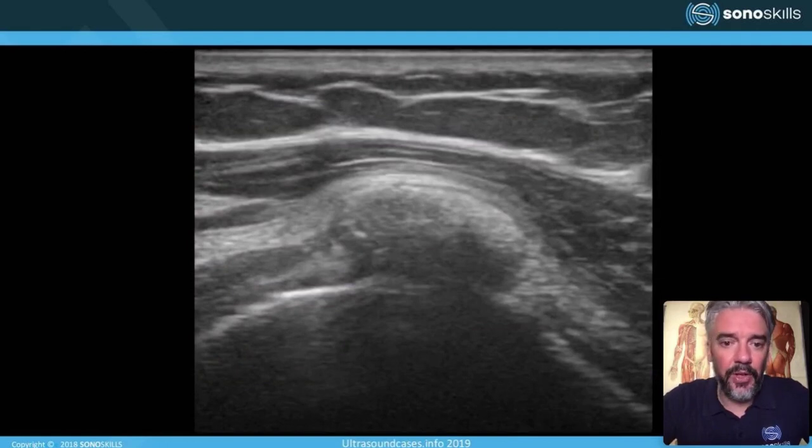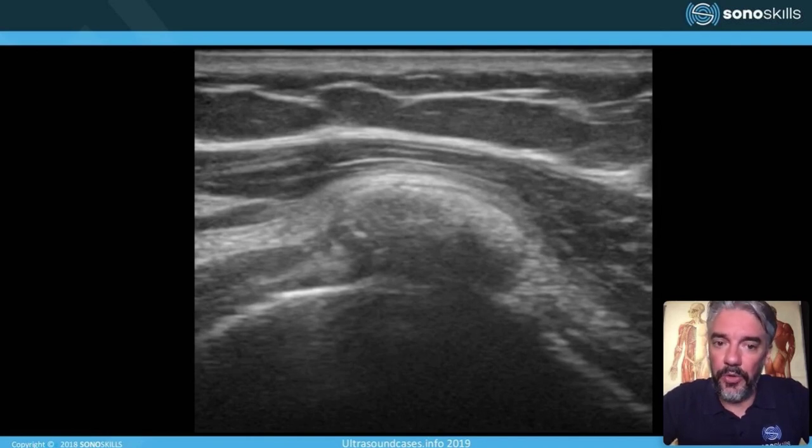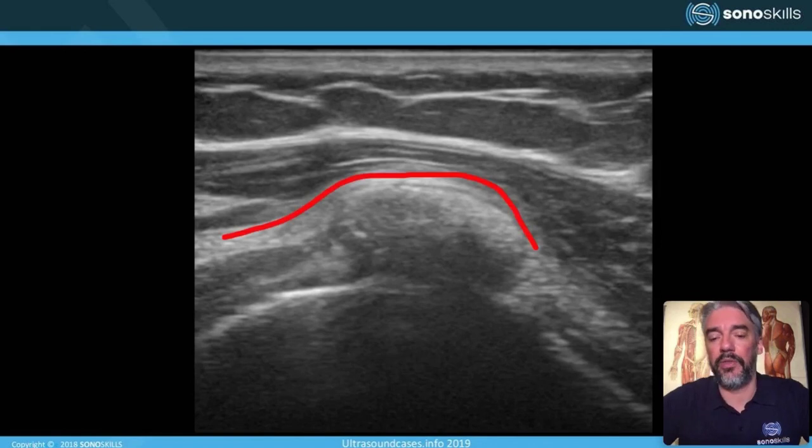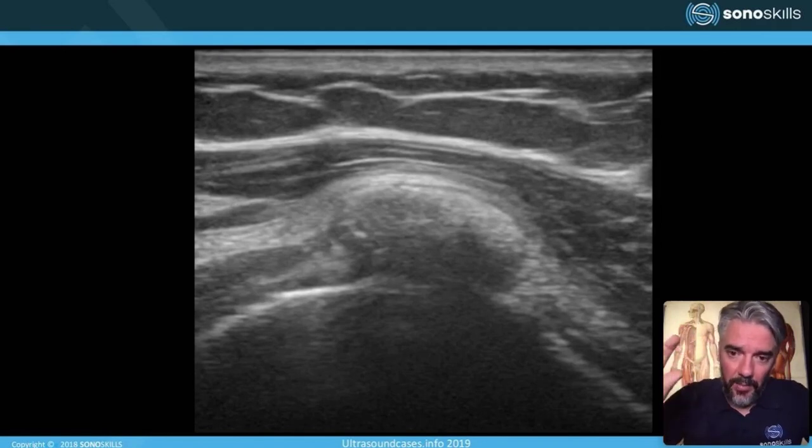A calcification with a faint shadow. So this is a type 2, almost a type 3. Now I would say a type 2 calcification, and it's producing a convexity. And then the question is, is this intrabursal or is it actually intratendinous? And in this case, it's intratendinous, following the bursa, and is actually on top of the calcification.